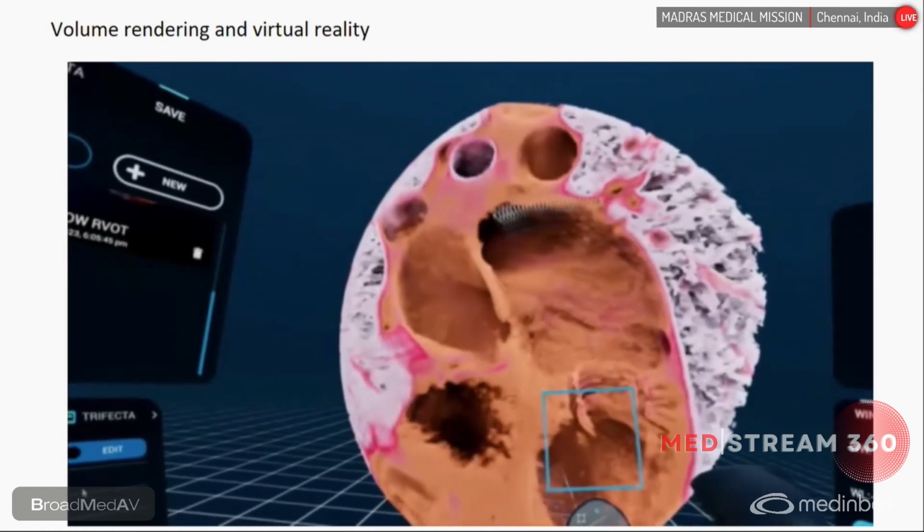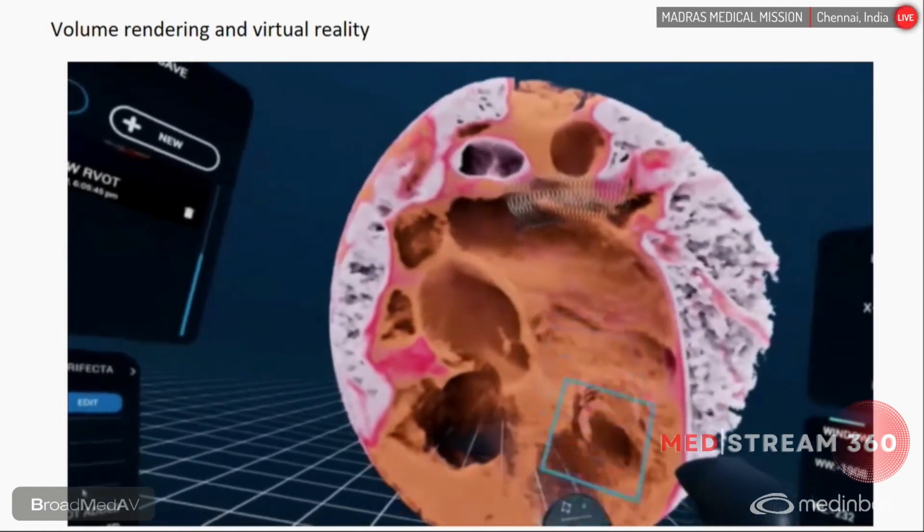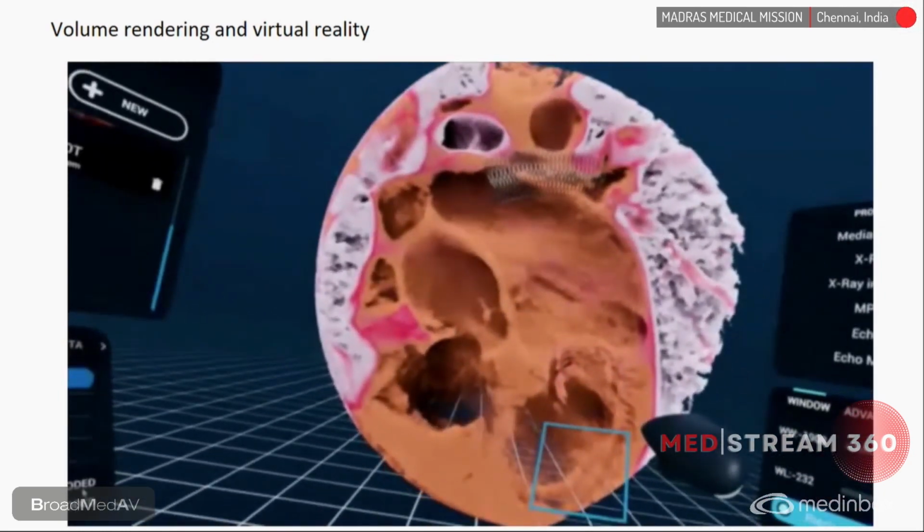So the plan is to stent the LPA. So if we stent the LPA virtually, we can see that the stent in the LPA is quite far compared to the proximal stent where we have to redilate and should do melody valve implantation. So this should not affect the procedure that is done in the proximal stent and the pulmonary valve.